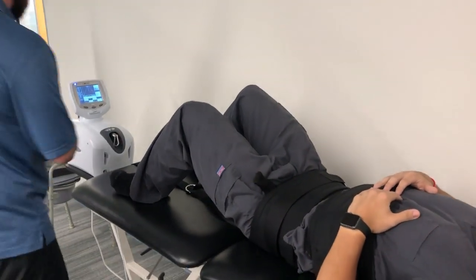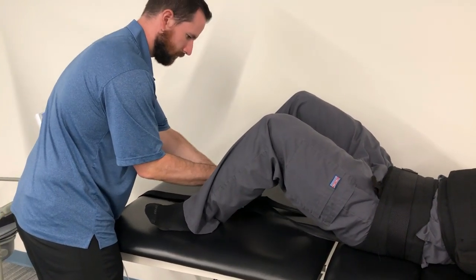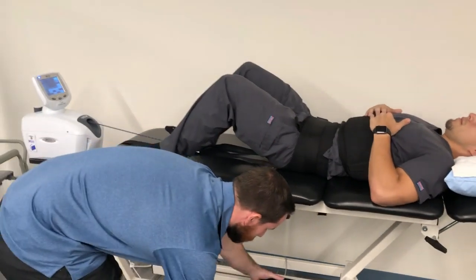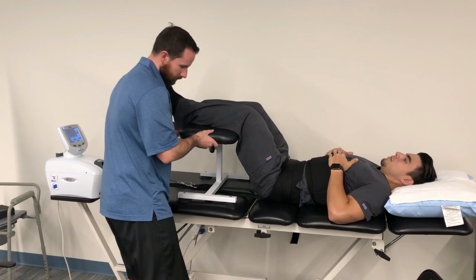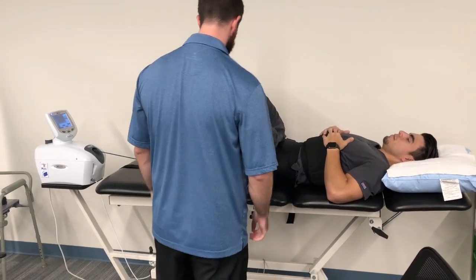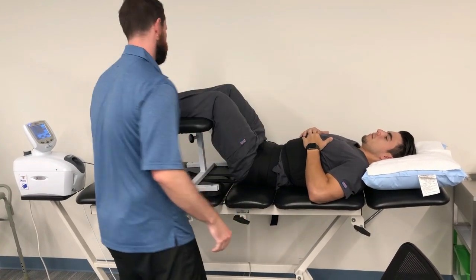Okay, so next I'm going to hook you up to the machine. Okay. So we've got you taut there. Next we want to make sure that your knees and hips are flexed so that they're both at 90 degrees. So I'm going to move this a little bit closer towards you. Okay. Does that feel okay there? Mm-hmm. Okay, make sure that's stable. And then I'm going to go ahead and unlock the table.